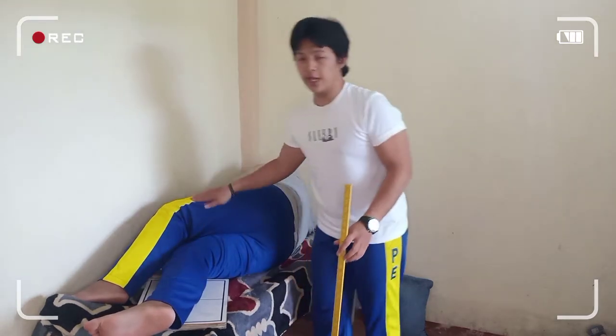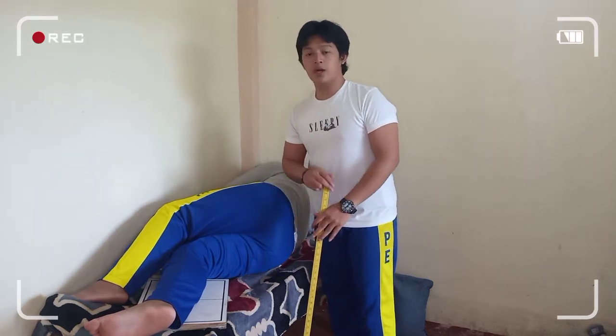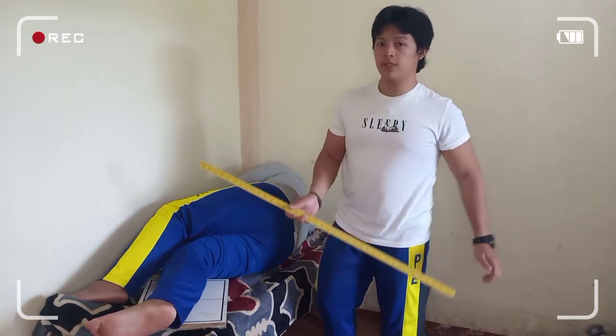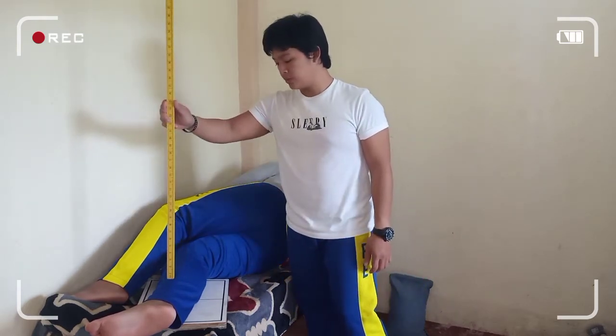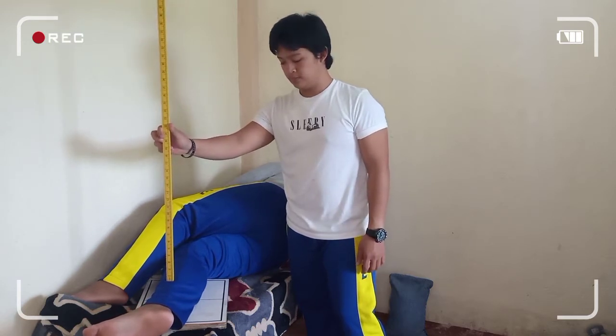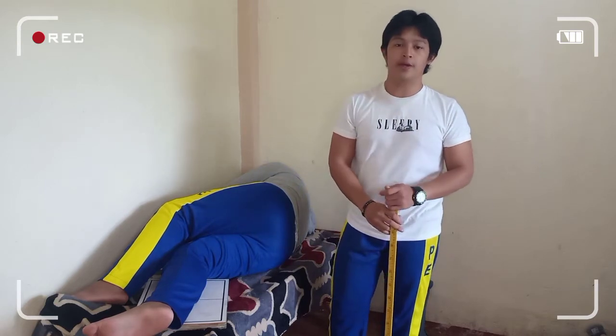Kasi pag itong left foot ang nandito, is uncomfortable siya dun sa ating patient. And the central ray must be perpendicularly directed to the mid of the leg. The structure shown in this projection is tibia and fibula.